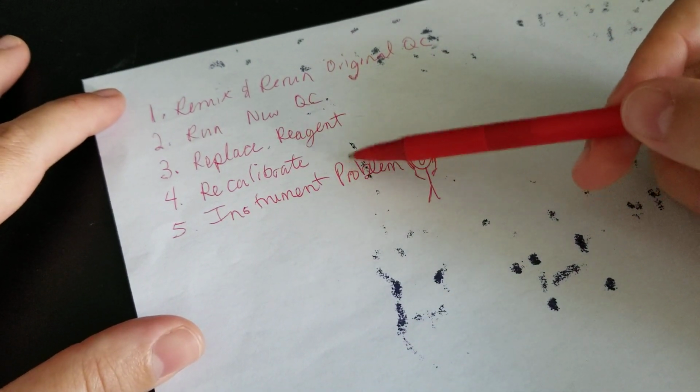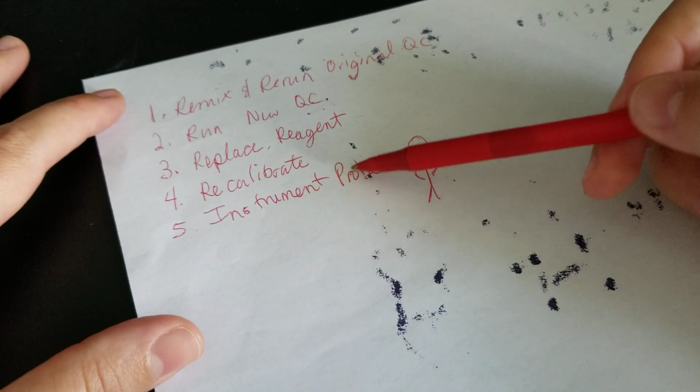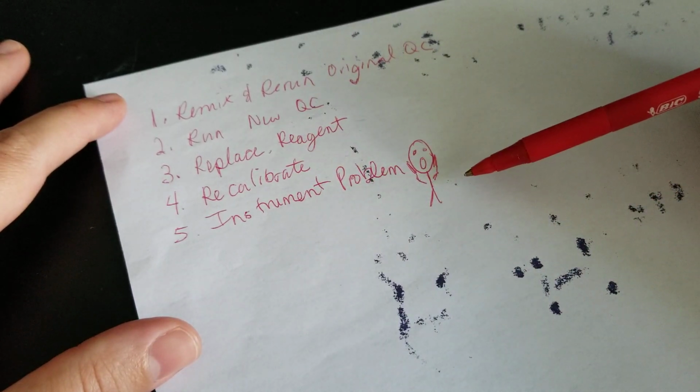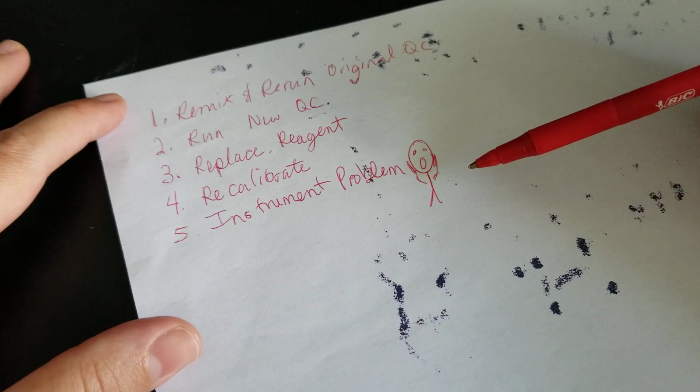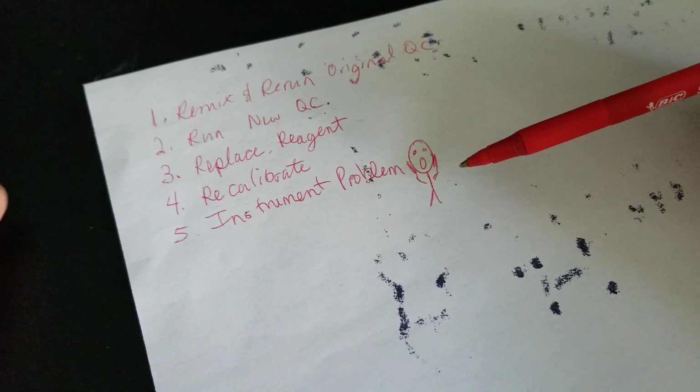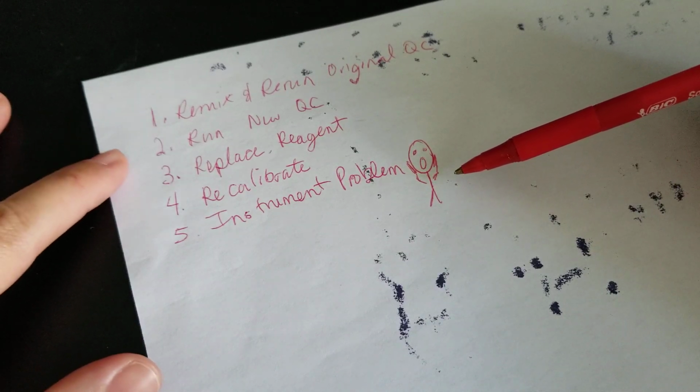But if it is an instrument problem, it could be something as simple as the monthly maintenance wasn't done or the weekly maintenance wasn't done. And maybe there's some residue on the sample probe or the reagent probe that somebody just didn't want to take the time to clean off. And so it might be something as simple as that.